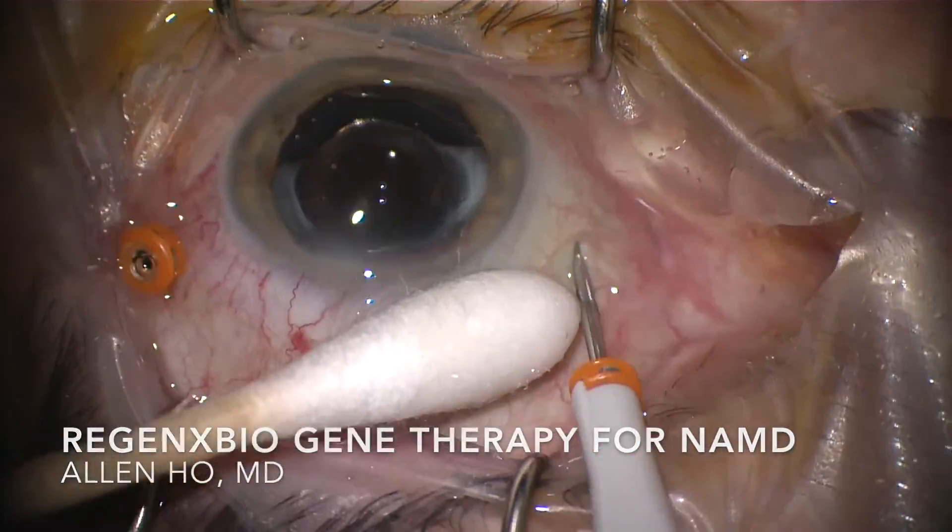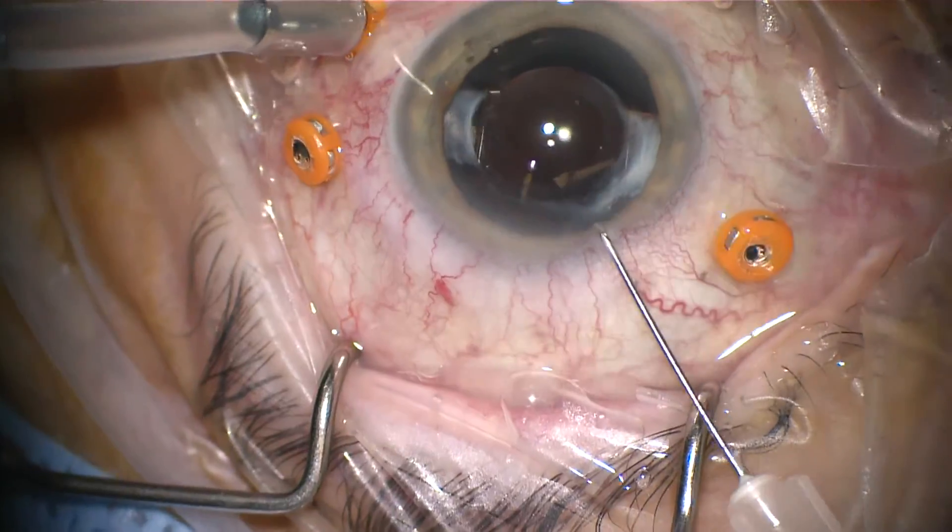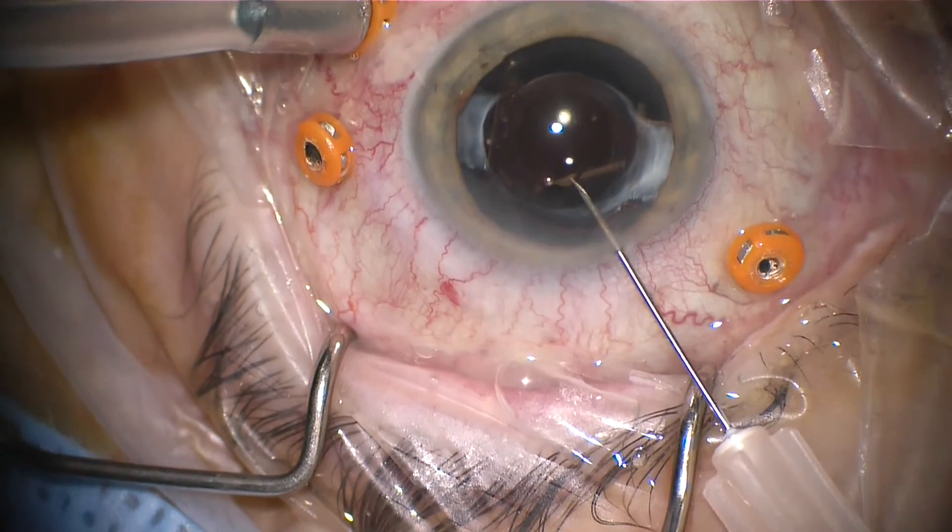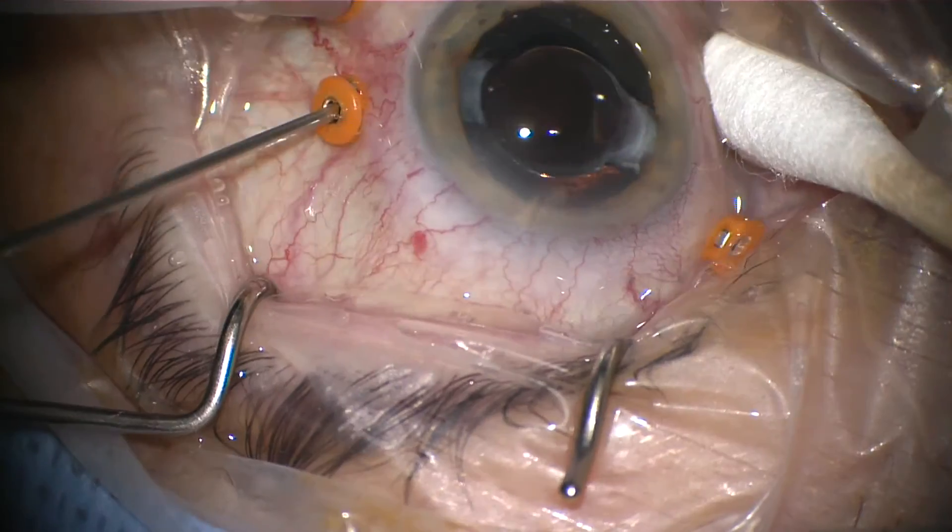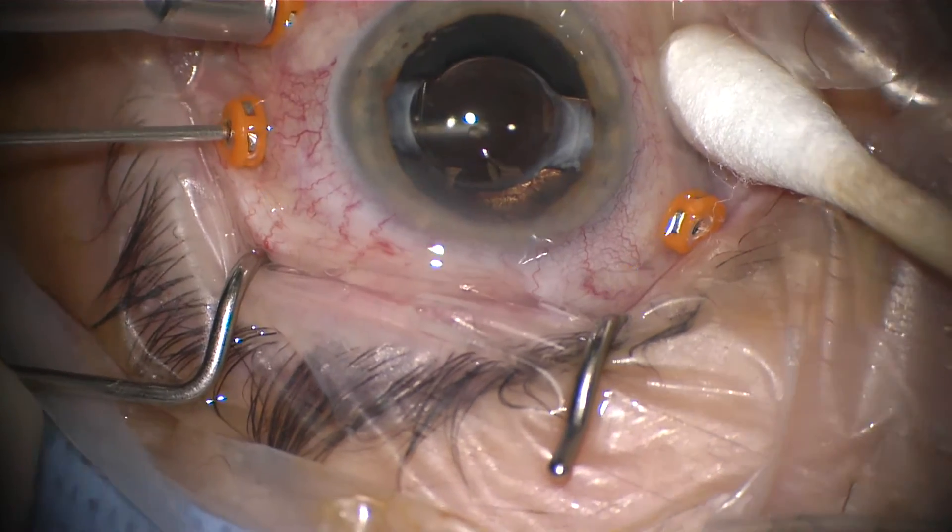Standard 3-port pars plana vitrectomy is performed and pure anterior chamber and vitreous samples are obtained to check for neutralizing antibodies to the viral vector AAV8.